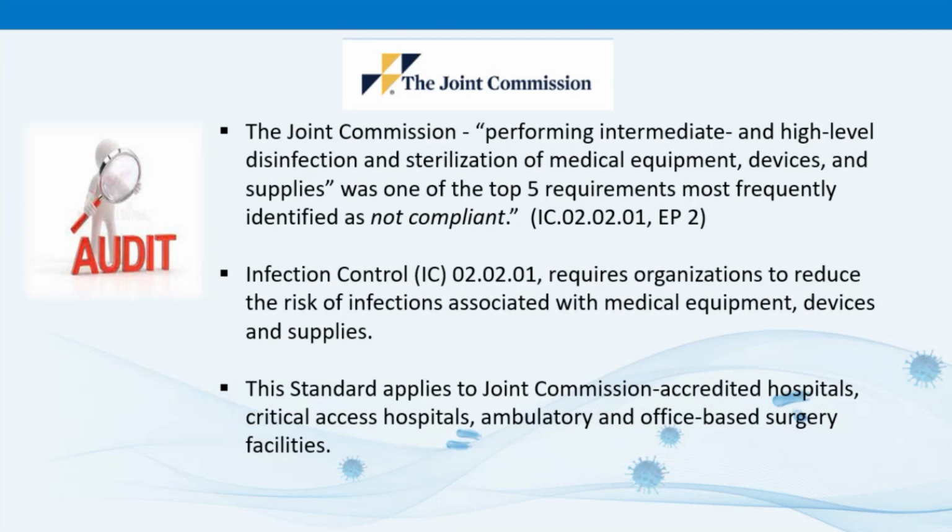Now, the Joint Commission also found challenges with leadership: a lack of leadership oversight, a lack of a culture of safety that supports reporting of safety risks. HLD is seen as a low priority within the organization, and there's no dedicated staff to oversee proper HLD. Also, a lack of facility design or dedicated space to properly perform HLD. So staffing, training, facility design, IFUs, and leadership are several of the HLD challenges identified by the Joint Commission.